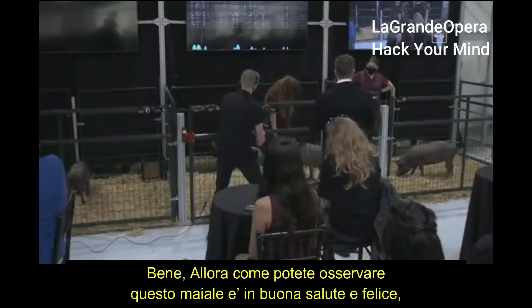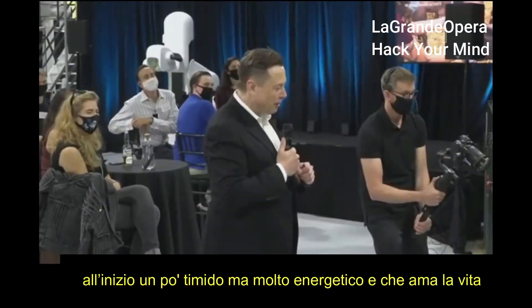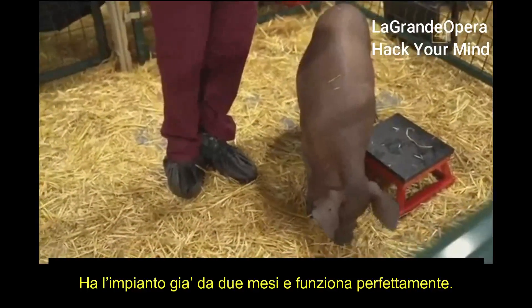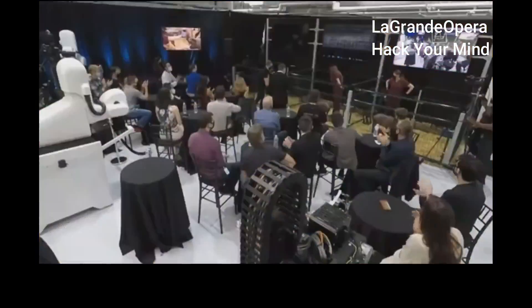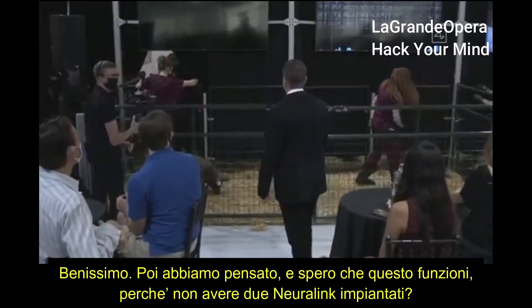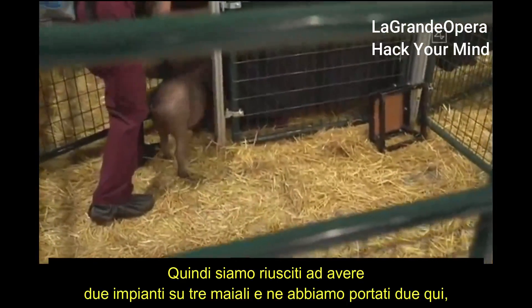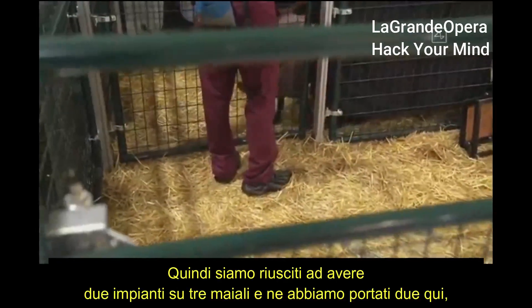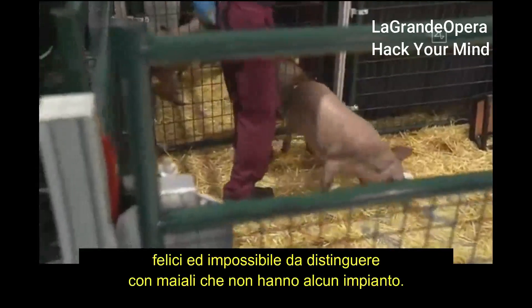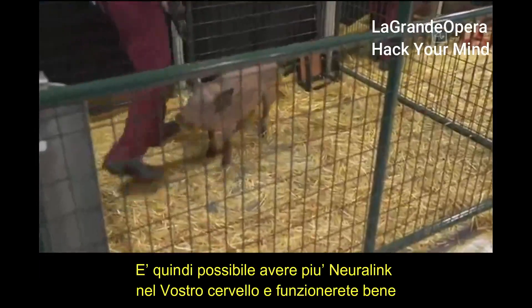We have a healthy and happy pig — initially shy, but obviously high energy. She's had the implant for two months and it is working well. We also asked: what if we do two Neuralink implants? We've been able to do dual neural link implants in three pigs, and we have a couple of them here. We've shown that you can have multiple neural links implanted and be healthy, happy, and indistinguishable from a normal pig. It's possible to have multiple links in your head sending out signals and working well.